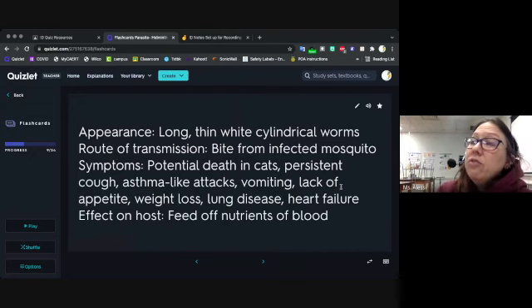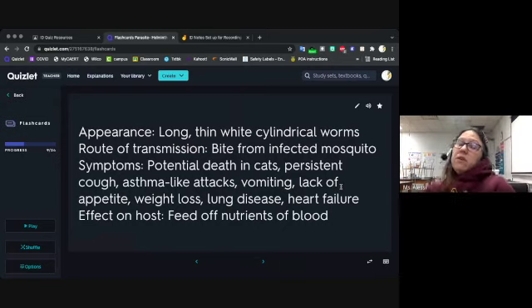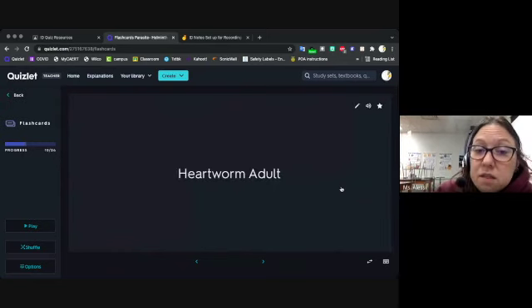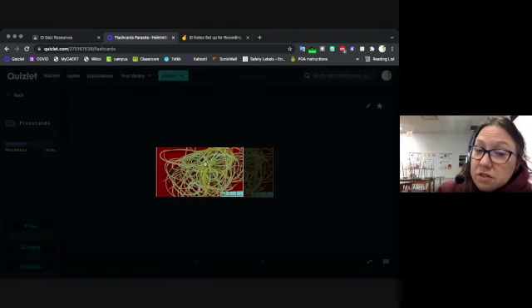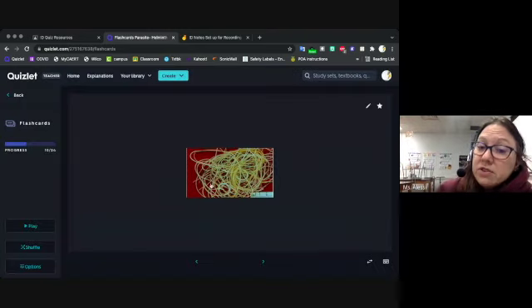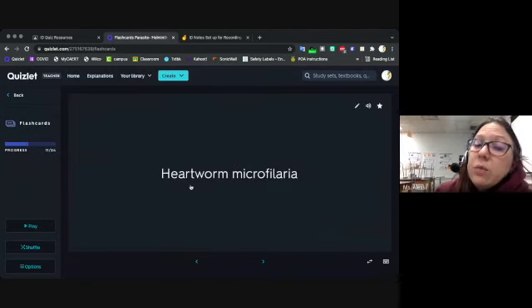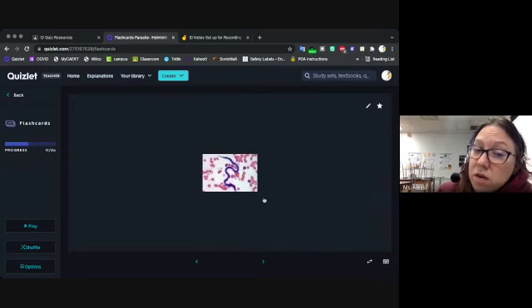So you should have your animal on heartworm preventative year round to make sure that they don't get heartworm. And it's very, very expensive to treat, if you're fortunate enough to be able to treat it. So heartworm adults just look like stringy pasta, almost angel hair pasta, if you will. That is what the larva look like, and we call heartworm larva microfilaria. They are little tiny worms, and you'll see them in blood smears if you're lucky. So that is just a little tiny larva right there, and it's called a microfilaria.